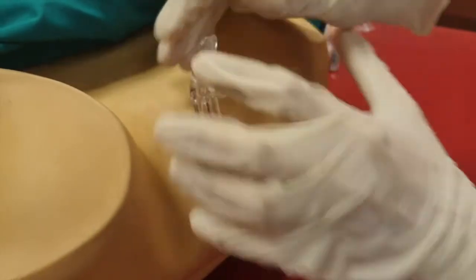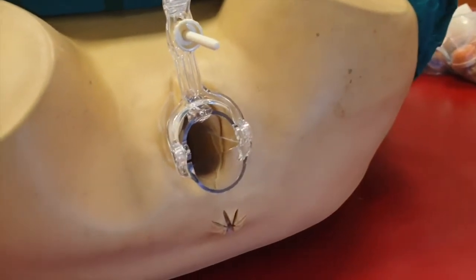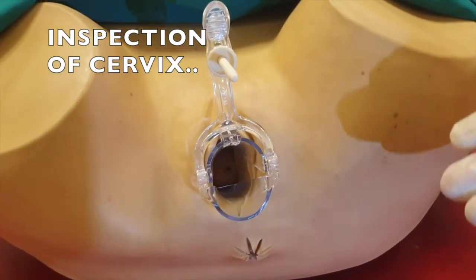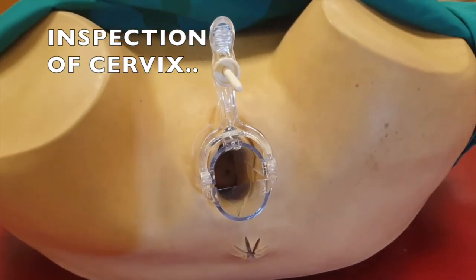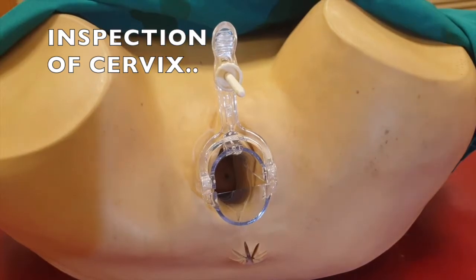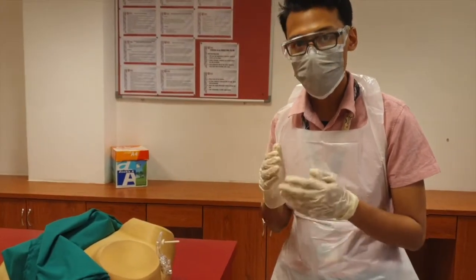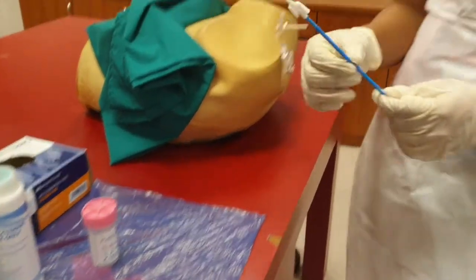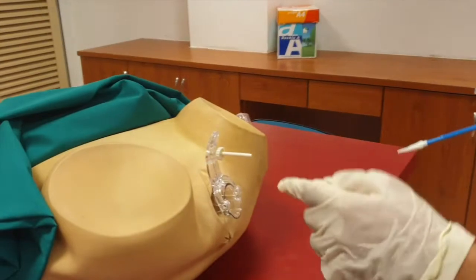Now as you can see, once we put the speculum in place, we can actually visualize the cervix or the ectocervix of the patient. Again, look for any obvious abnormalities, any mass, any bleeding, discharge. Once we've inspected the cervix visually, we'll proceed with the specimen collection. What we need is the cytology brush. As you can see, I will be inserting the cyto brush within the speculum.